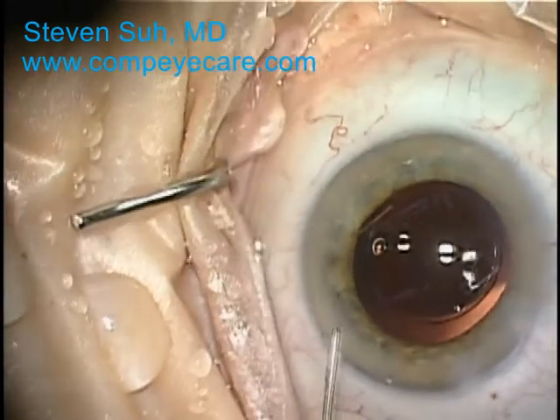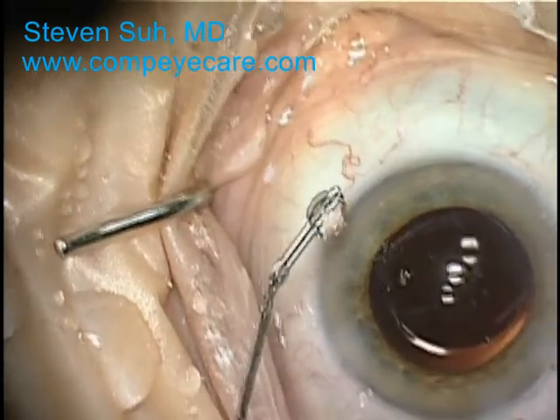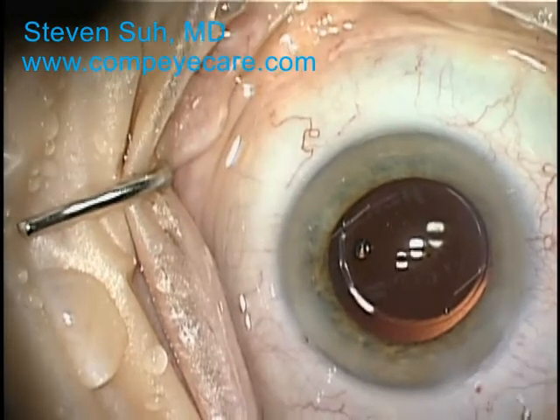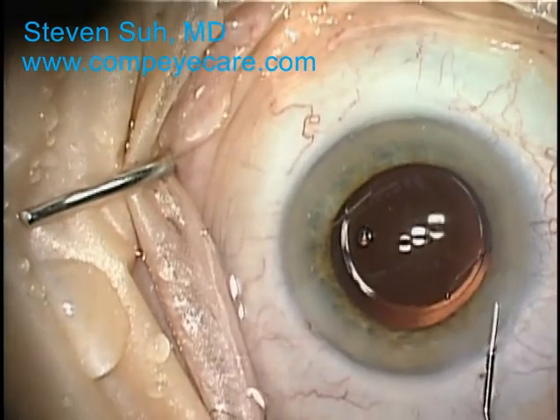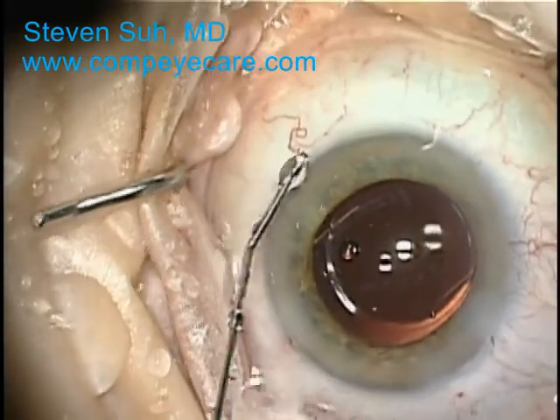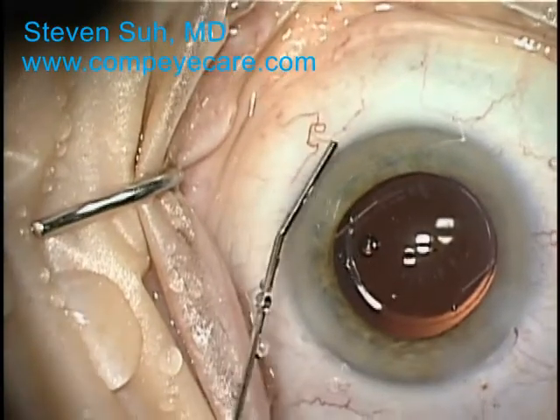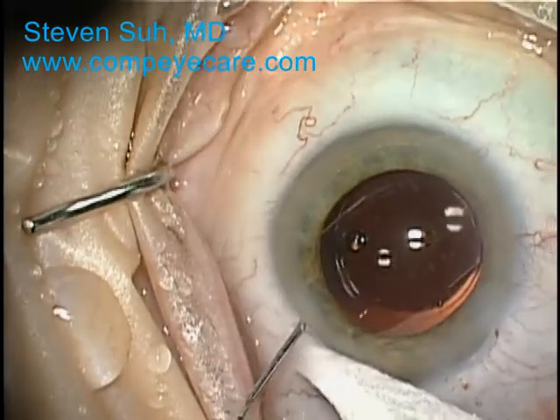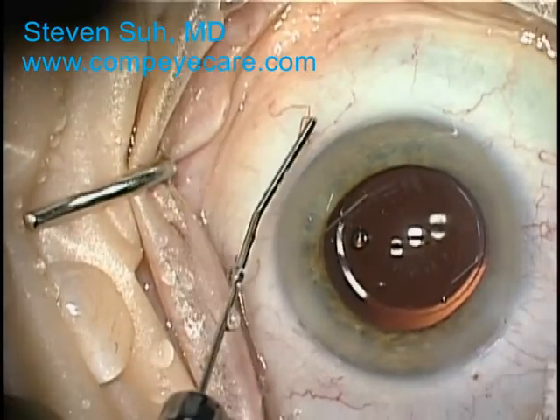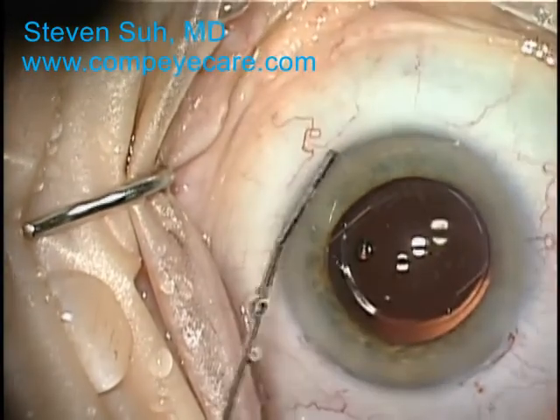This maneuver is called stromal hydration, where I squirt the saline solution into the edges of the incisions to create some temporary corneal edema to help with spontaneous closure of these incisions. If these incisions self-seal, then I do not have to use sutures to close them up. I check the incisions multiple times to ensure that they are indeed sealed correctly and that the eye pressure is within normal range. Proper sealing of the incisions will greatly reduce the risk of a post-op infection.